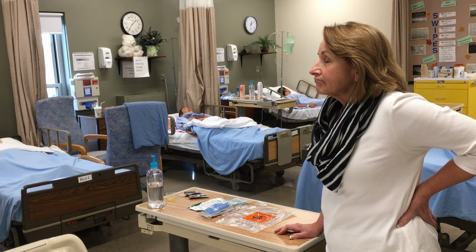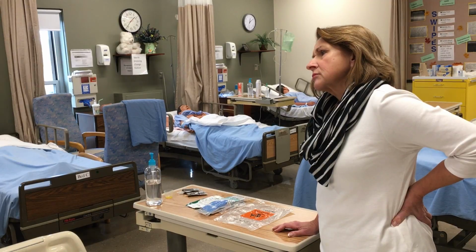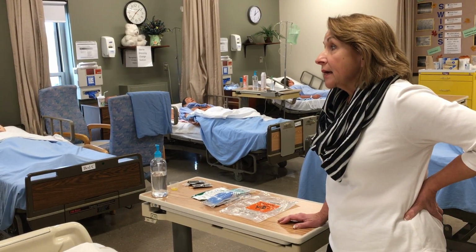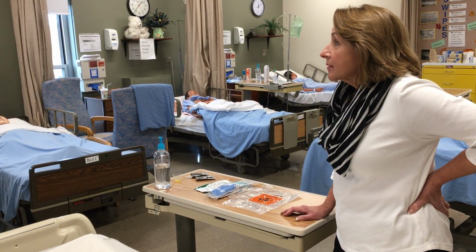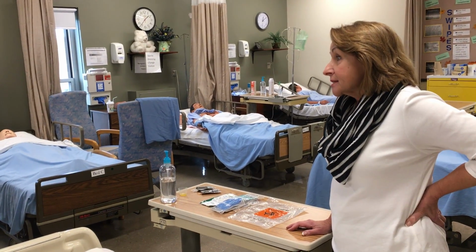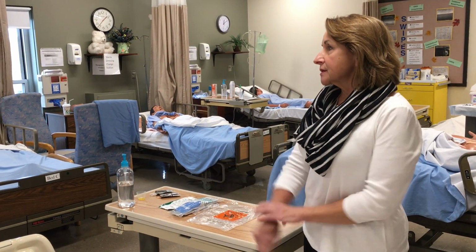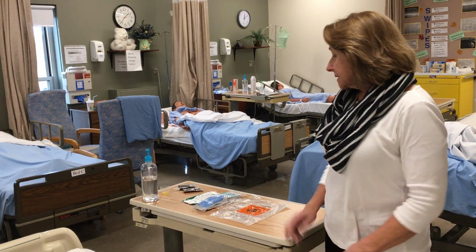What's in there? Silicone-coated latex Foley tray, 16 French 5 ml catheter, pre-connected closed system. Okay, 16 French, good. For an average adult. So if we were going to cath a little kiddo, what size catheter would we use? 12, or 10, 8. It just depends on the age of the child. If you were cathing somebody who had hematuria and a lot of blood clots, would you use the 16? No, you'd probably go 22, 24. Good. What else is in there?